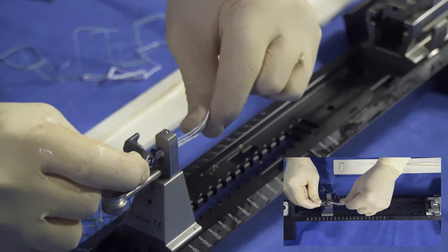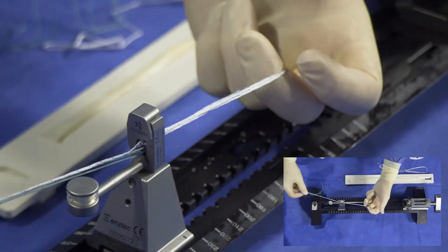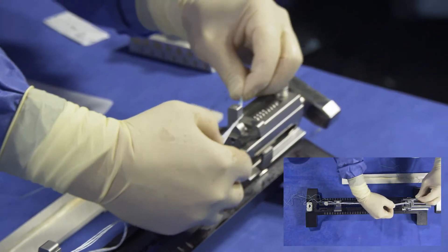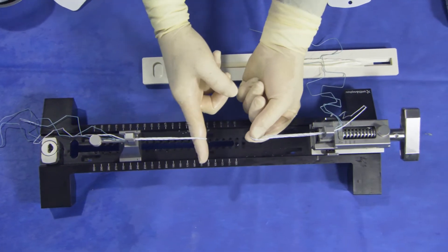Once harvested, the semi-tendinosis tendon graft is prepared using the Smith & Nephew X-Wing Graft Preparation Station. Two ultra buttons are utilized and loaded onto the station. To load, the clamps are opened and then closed around each button.